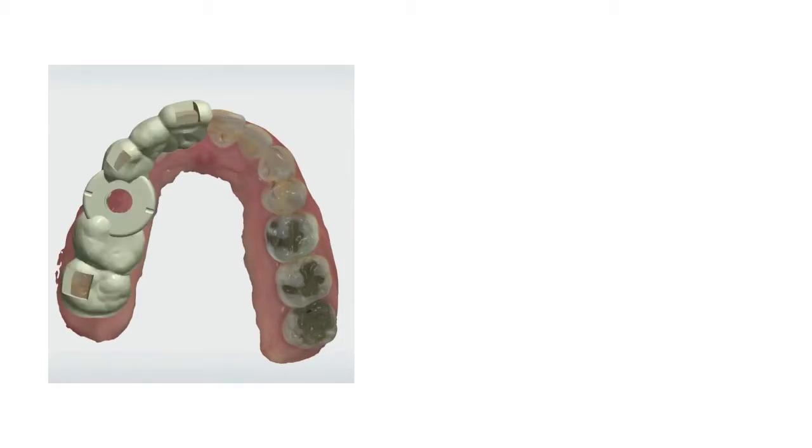So number 1, a surgical guide for a fully guided surgical procedure is going to be made and is designed directly on that model. I have to send nothing else for that patient. I don't have to take study casts with conventional material. I don't have to send them conventionally to the laboratory. I don't have to have them do a conventional wax up, send it back, verify it, validate it, take a CT with a barium template or any of those things.